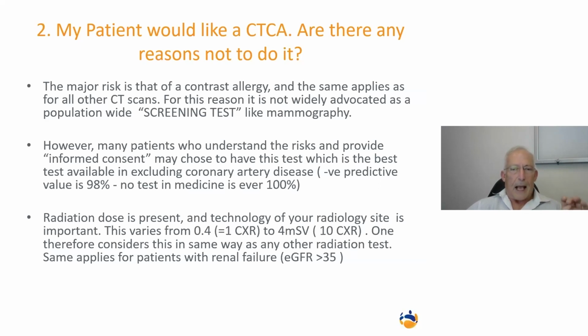And unlike mammography, which is generally done non-contrast, although mind you, we have some newer applications where you can use it. So the big issue really is just the contrast issue, which I think all GPs, all doctors are aware of. And for most clinical indications, if someone needs a test, you do the test. You just explain it to the patient, make sure they consented properly. So I think that if patients understand the risk provided, you need to have informed consent for them, and they can choose to have the test if you explain to them that it is the best test available in excluding coronary disease. It is a better test in excluding disease than a catheter angiogram.